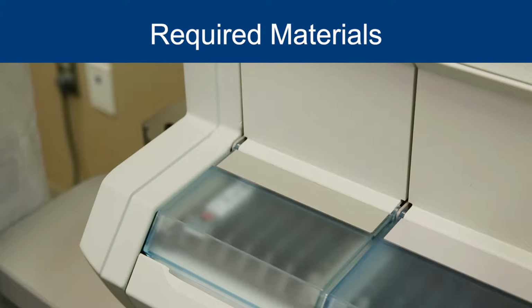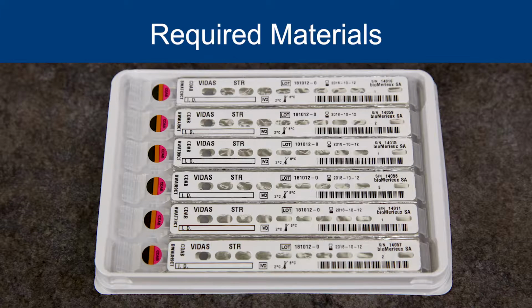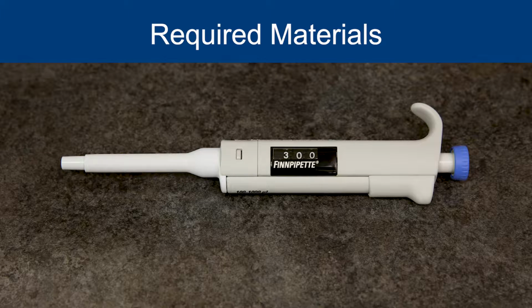You will need the VIDAS instrument, the VIDAS C. difficile Toxin A and B CDAB assay kit, part number 30118-01, and a calibrated pipette with disposable tip to dispense 200 microliters, 300 microliters, and 1,000 microliters.